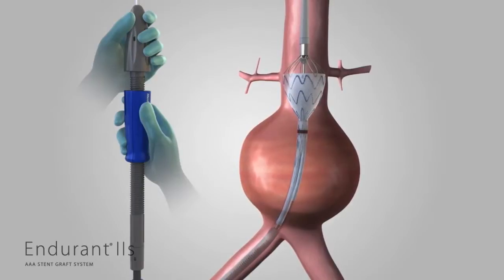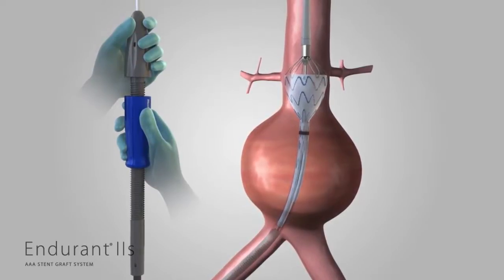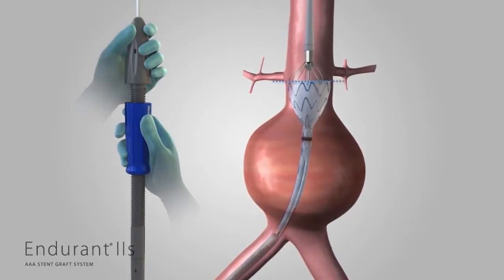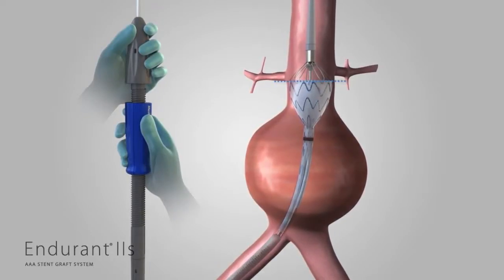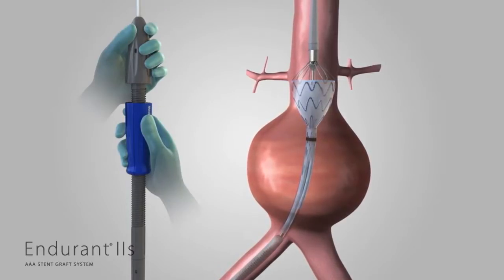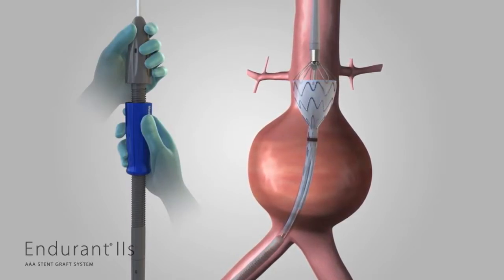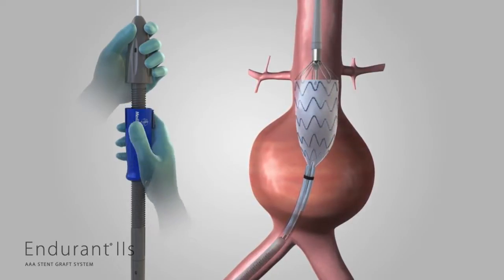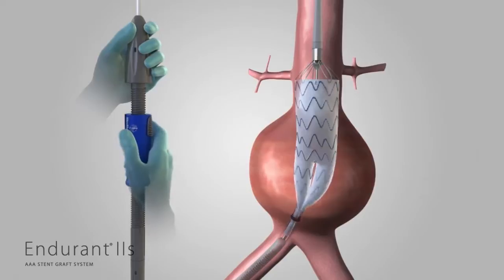If needed, gently move the entire delivery system proximally or distally until the proximal edge of the graft material is even with the distal edge of the lowest renal artery. While continuing to hold the delivery system stationary, slowly rotate the slider counterclockwise until the graft cover is withdrawn to the point that the contralateral leg is released from the delivery sheath.